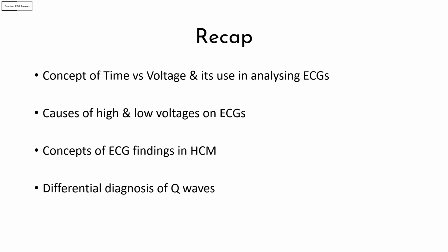Then we also discuss the condition where you can get LVH with disproportionately deep Q waves. Remember, LVH is usually associated with small or absent Q waves. We discussed the ECG findings of HCM. Rather, we analyzed the ECG and came to a diagnosis of HCM.